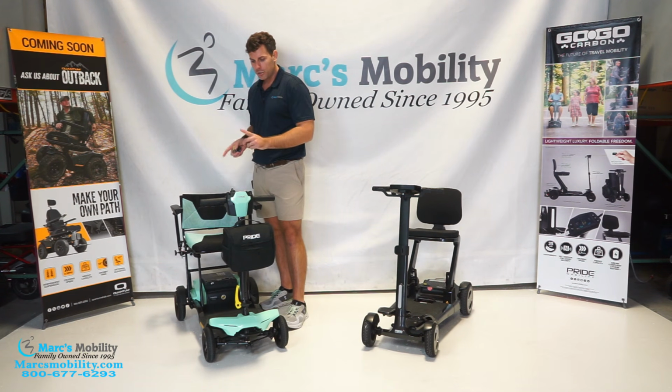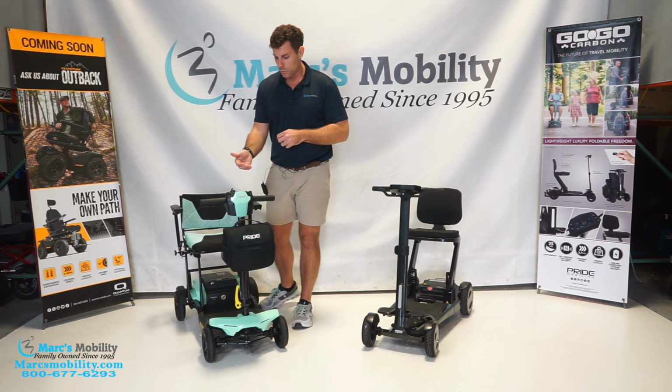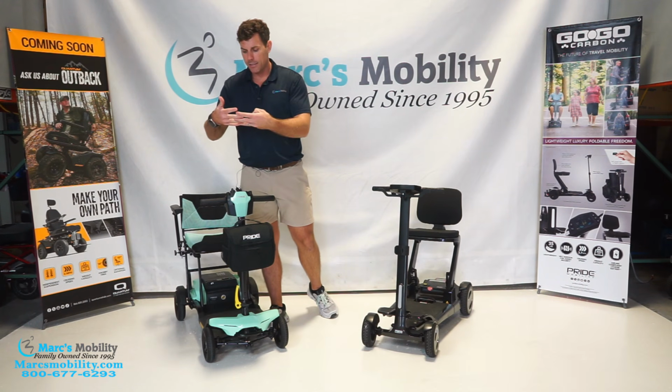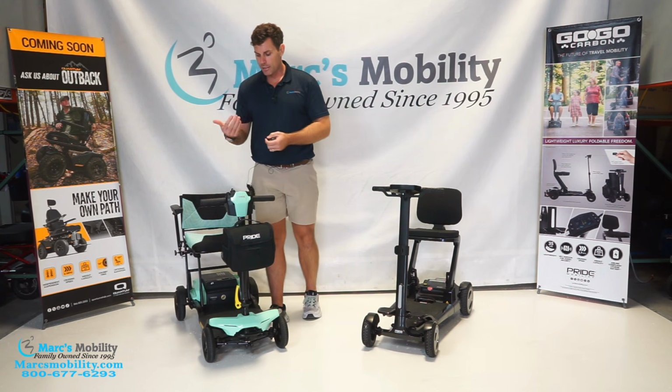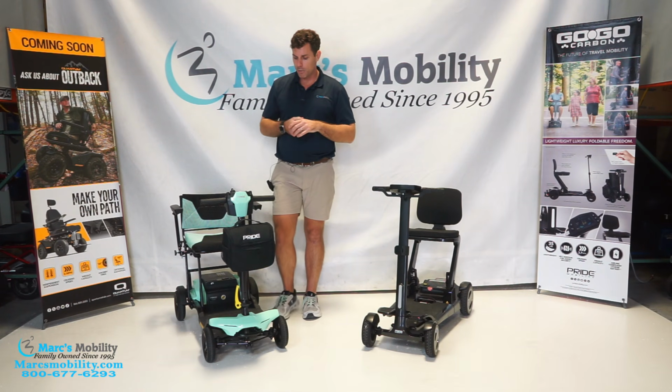So you can charge this unit either way. The tiller is also adjustable as well with this yellow handle. If you pull this out, it's just interlocking gear-like teeth, and you can adjust this tiller not only in height, but also in depth, forwards and backwards.